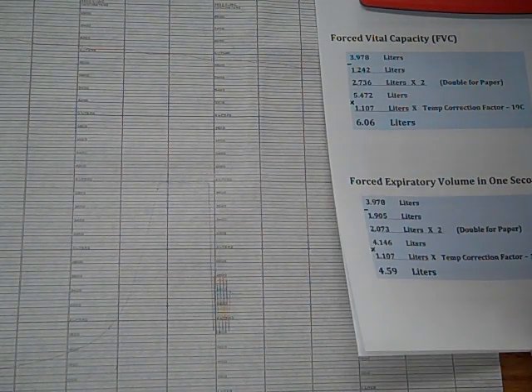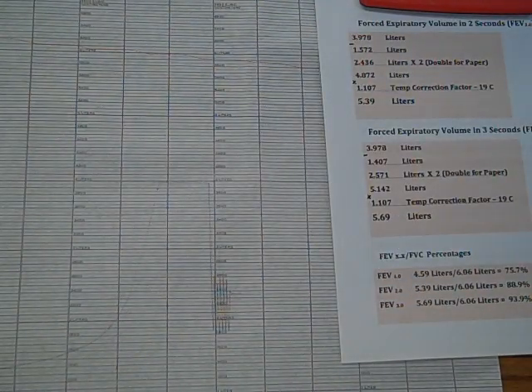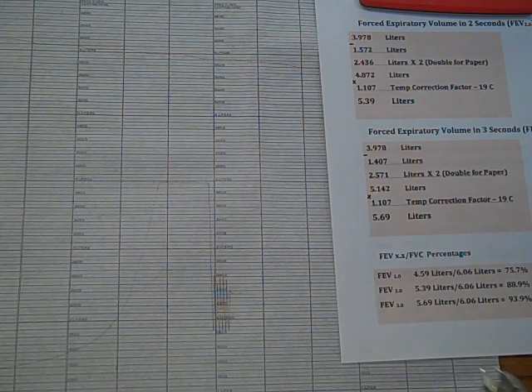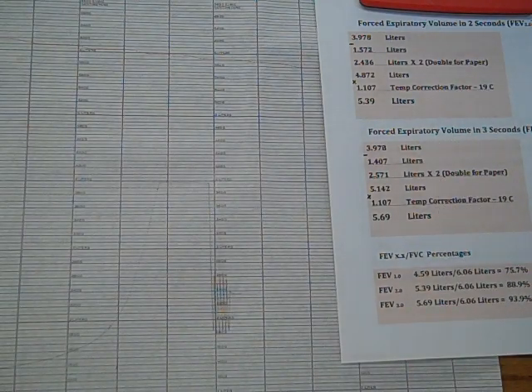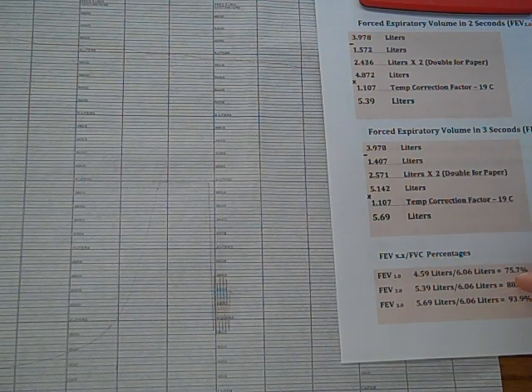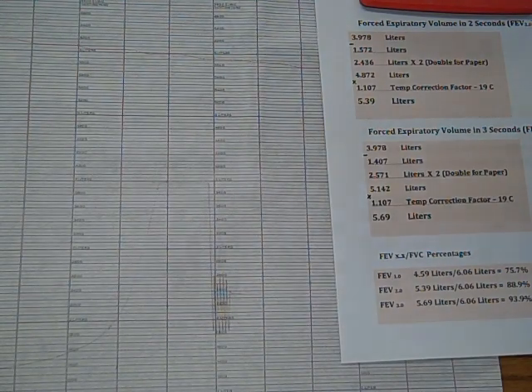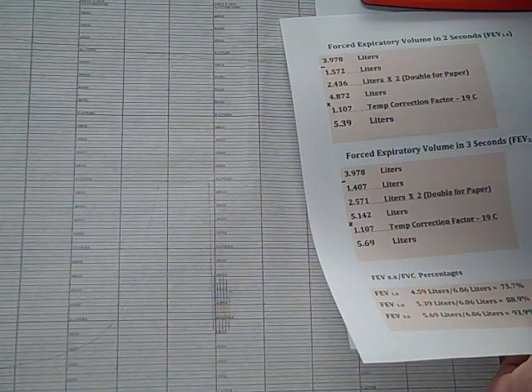Now, once we've gotten those 2 and we've determined which one of our 3 tracings has the highest combination, we'll go through and do the rest of the computations, the forced expiratory volume in 2 seconds. We measured 1 second. Now we would measure 2 seconds and 3 seconds and go through very similar computations to find out how much air was exhaled in 2 and 3 seconds. Typically, in the FEV1, a person would exhale roughly 80% of their vital capacity. In our tracing, we did about 75.7. Typically, at about the FEV2, they'd be around 92, 93%, and typically about 95, 97% in the FEV3. Other readings we might look at.